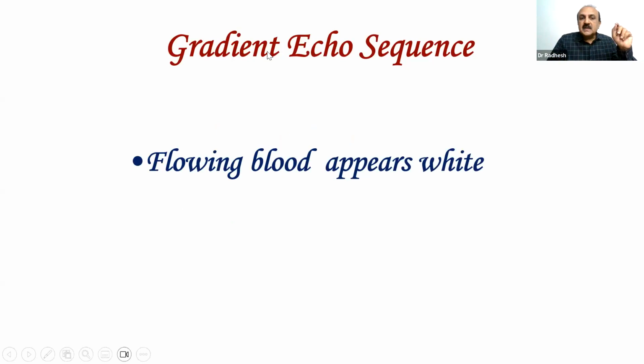Now, there is one more sequence. I'm introducing the fourth sequence. I'm not boring you with more. Remember, 5 sequences for today. I think you know 50% of MR. I am not exaggerating. These are the only 5 sequences you need to know as a surgeon. But as a neurologist, it may be different. Then as a musculoskeletal radiologist, it may be different. But for a surgeon, you need to know 5 sequences.